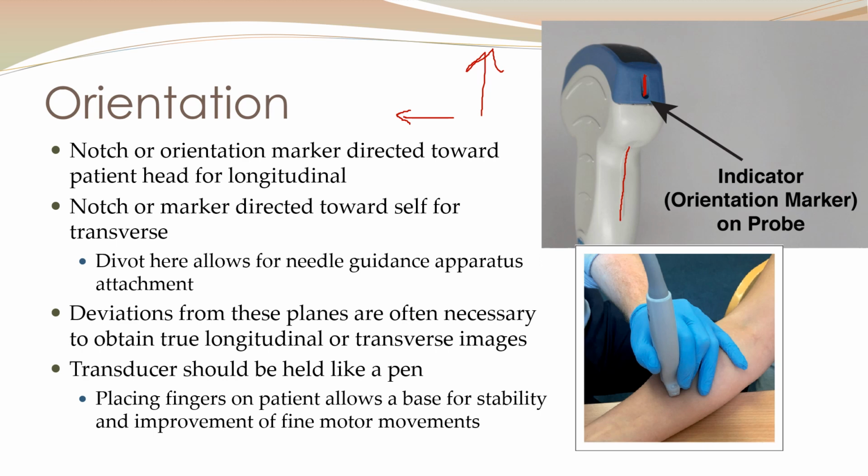And you'll find after you've scanned a little while, if you get your transducer flipped upside down or something, it'll just feel completely disorienting, because you'll be getting an image opposite of where you think you should be moving. All right.